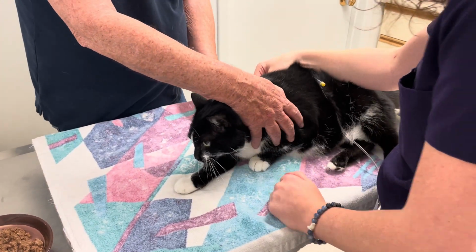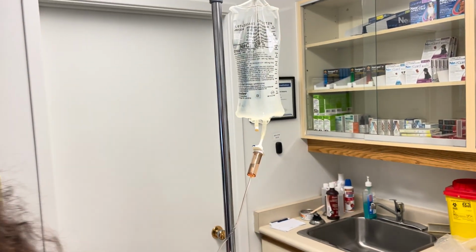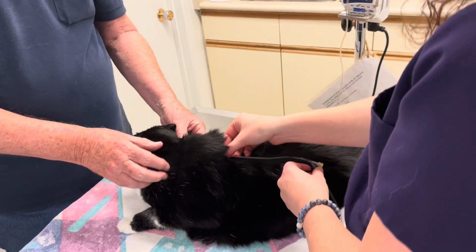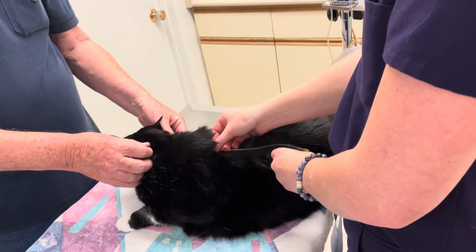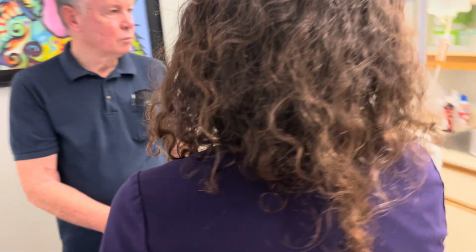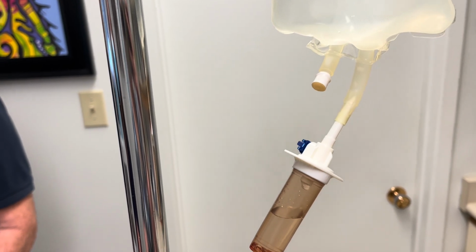So I'm continuing to watch my bag here as my assistant, Dr. White, is holding on to Oreo here for us. And I'm continuing to hold on to the tip here. So we're not nearly where we need to be yet. But we can see that it is coming out at a pretty solid rate still of about 25 drips per 15 seconds.